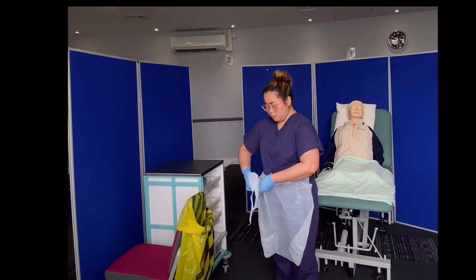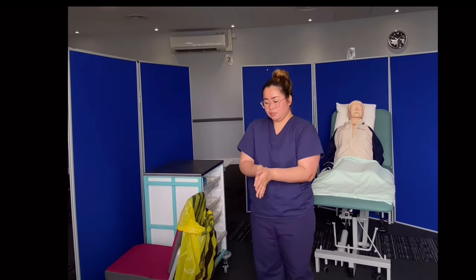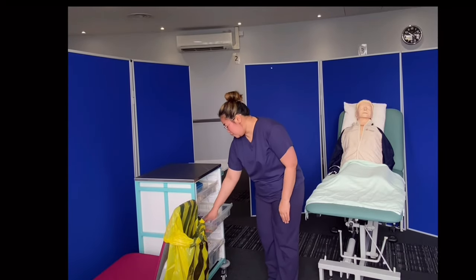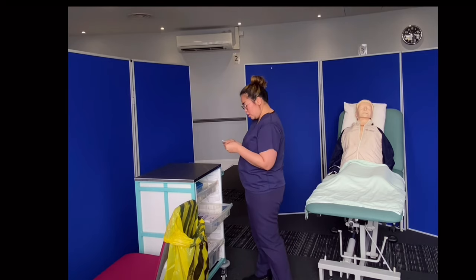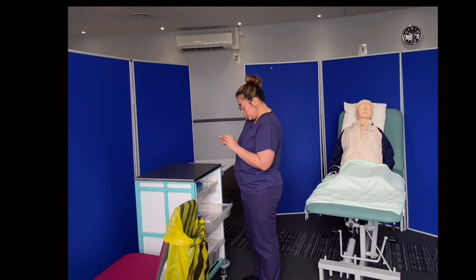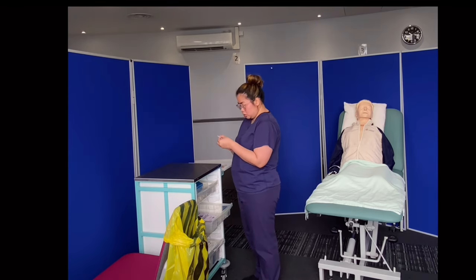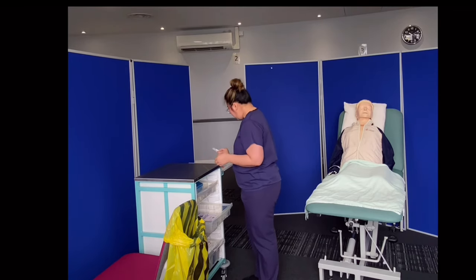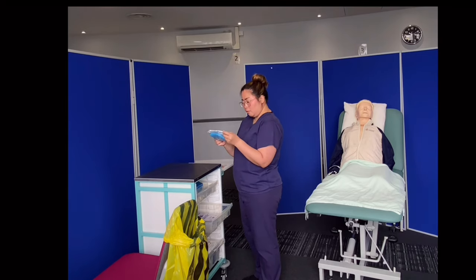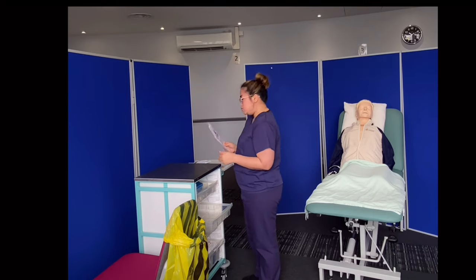While that's air drying, I'm going to remove my apron and gel my hands again. So now I will be checking if all my materials are here. I will need an upside dressing that I have seen in my wound care treatment chart — it's intact and in date, expiring in 2026. I've got my Clinell wipes to clean, my normal saline solution to clean the wound, which is intact and in date. And just in case I would need it, I'm going to prepare an extra pair of sterile gloves.